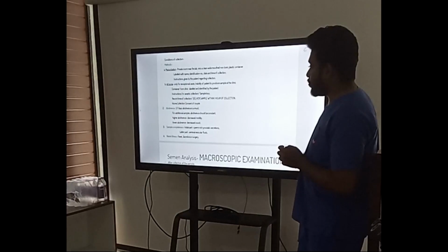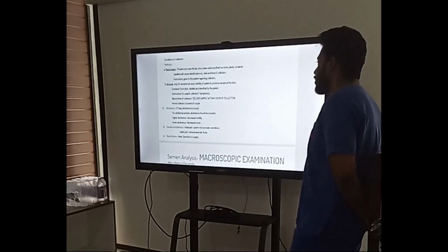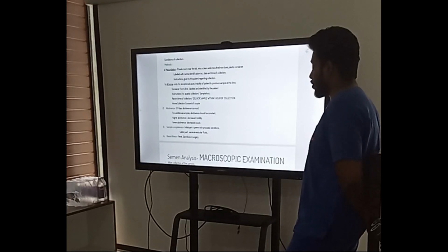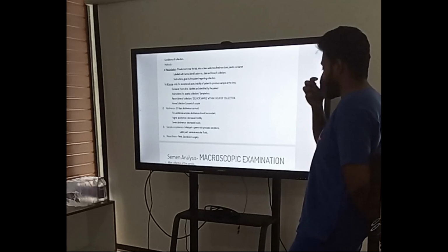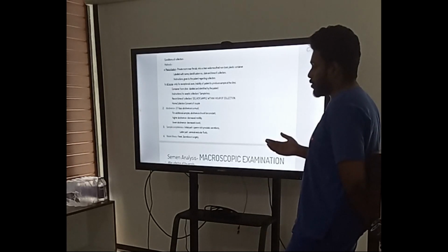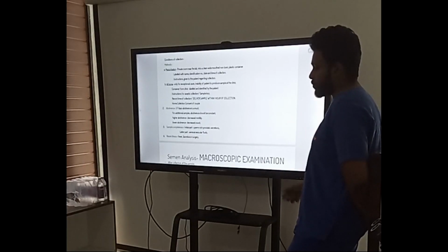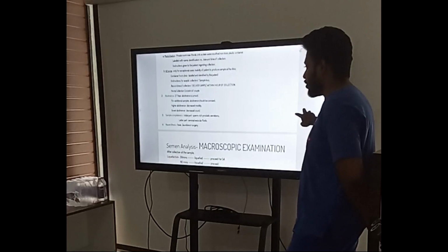And the abstinence should be 2 to 7 days. It is advised to have 2 to 5 days of abstinence. For an additional sample, abstinence should be constant, like 2 to 5 days. Higher abstinence decreases the motility, because of high accumulation of sperms, and when considered beyond 7 days, you can see a lot of immotile sperms. The lower abstinence will give you a decreased count.